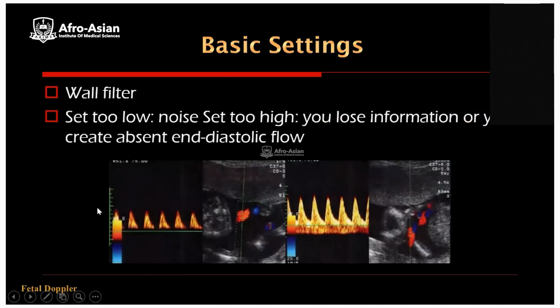In color Doppler settings, the wall filter: set too low, noise; set too high, you lose information or you create absent end diastolic flow. So if the wall filter is set very low, we will get noise.